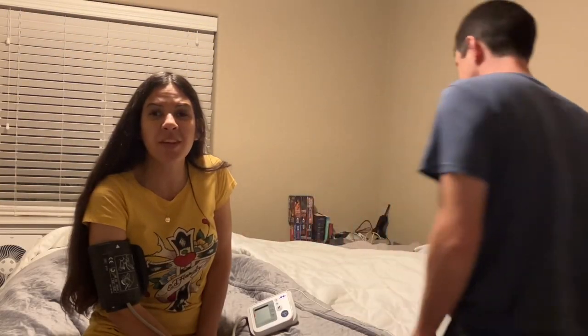Welcome to our messy room. So the first thing we do for my dialysis nighttime routine is we turn on the machine to heat up the liquid that's going to be going into my body, and then I weigh myself — which I already did because I didn't want to show you guys that part — and then I take my blood pressure and my heart rate. Richard is going to push the button for that right now. I have the cuff on my arm. I'm going to keep a log, and we have to log my vitals every single night.